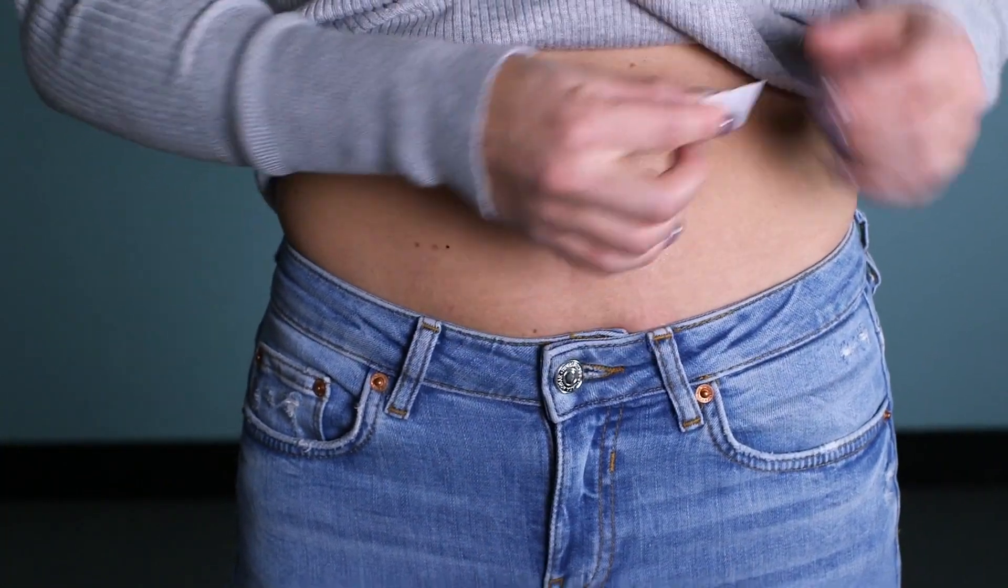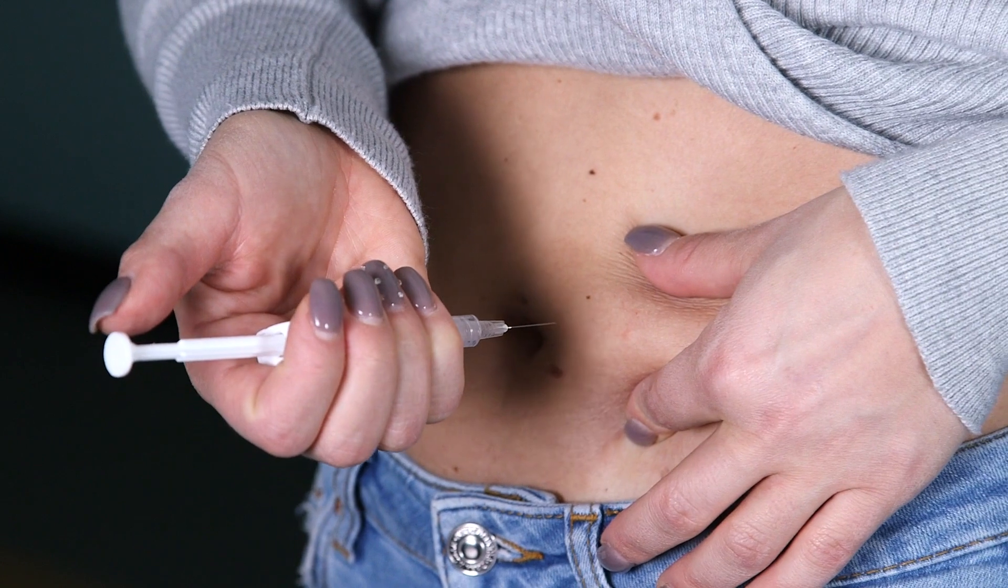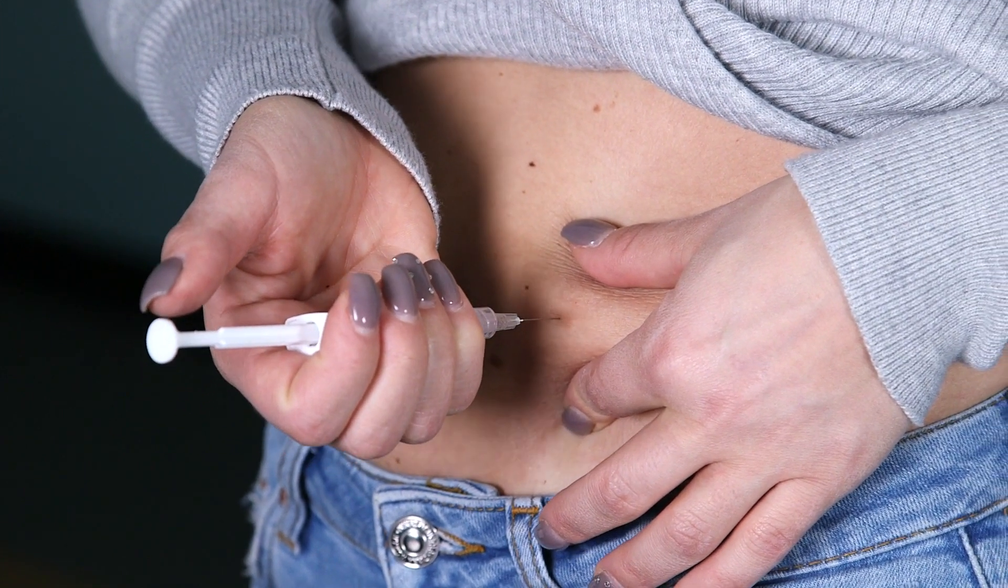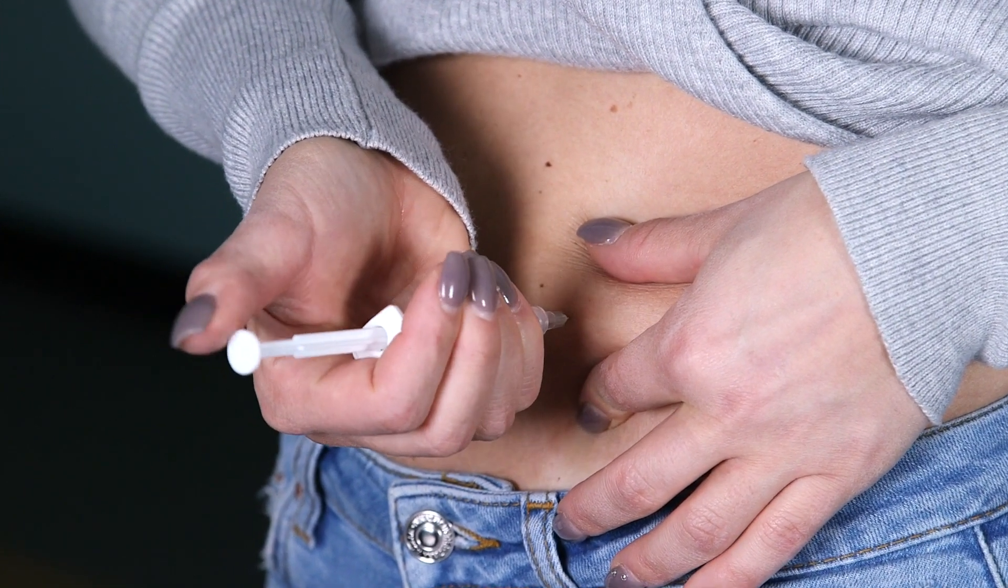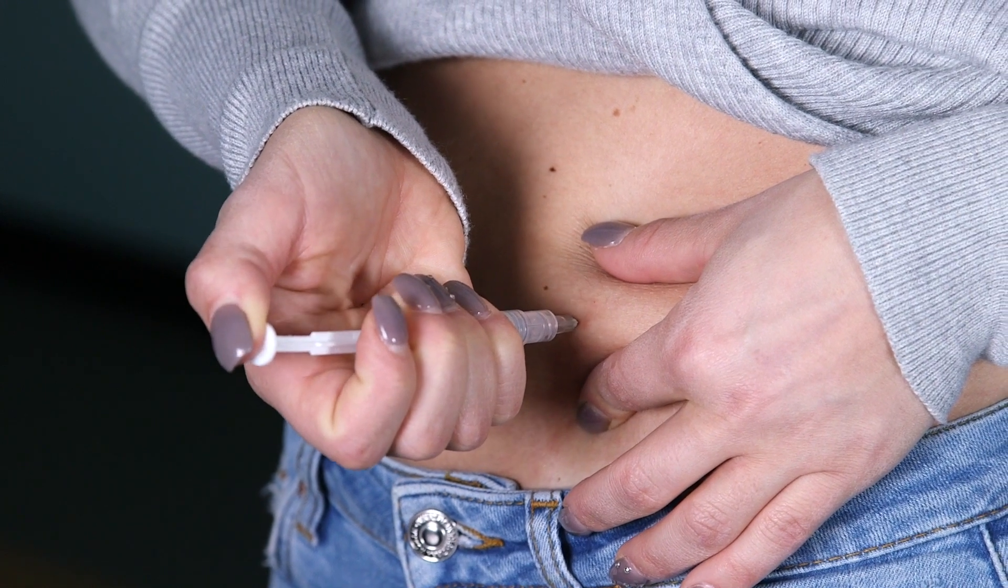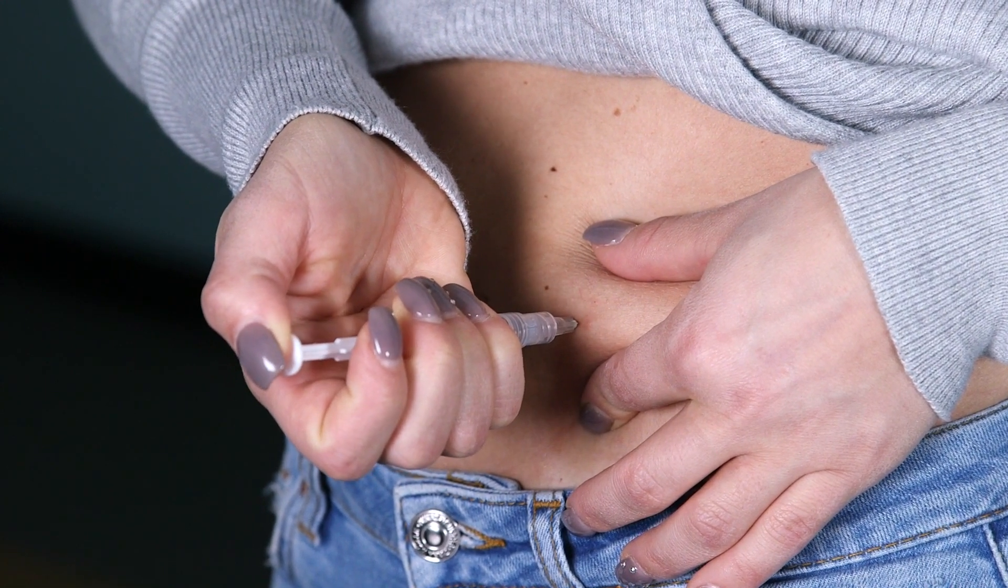Alcohol wipe the area and allow to dry. The needle goes straight in at a 45 to 90 degree angle. Depress the plunger until it's all injected.